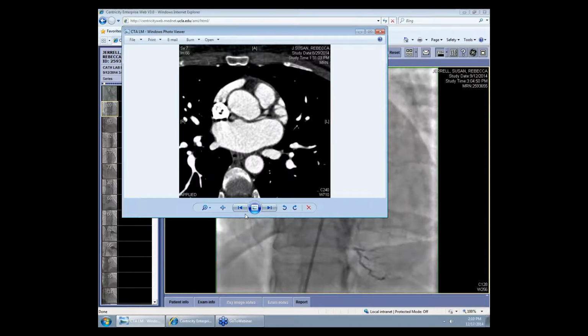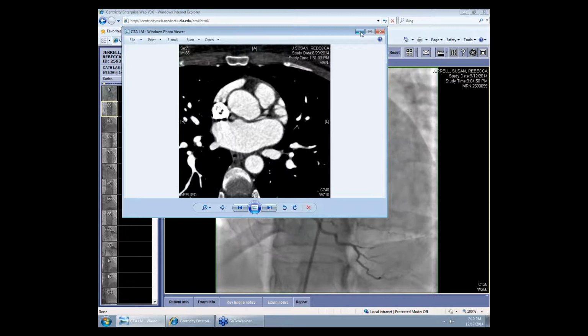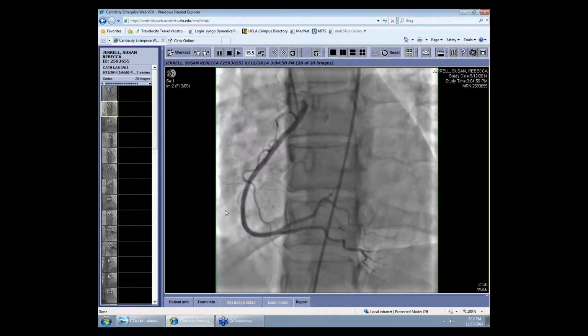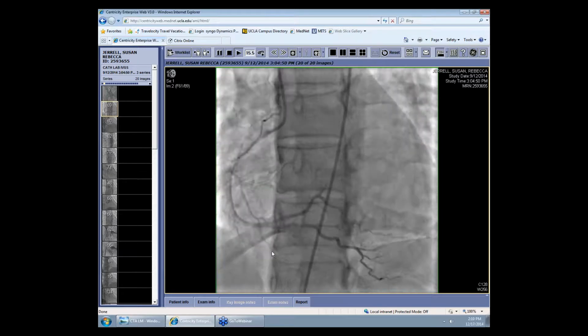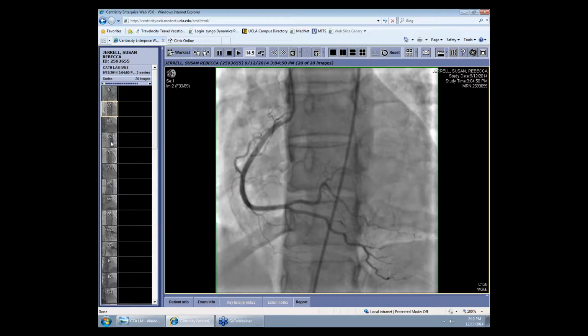She subsequently underwent a coronary angiogram for further evaluation and consideration of FFR and IVUS of the coronaries to determine the clinical significance. So here's the right coronary artery. Is that coming across okay, Eric? It's perfect for me. It was not good when we saw the CAT scan.